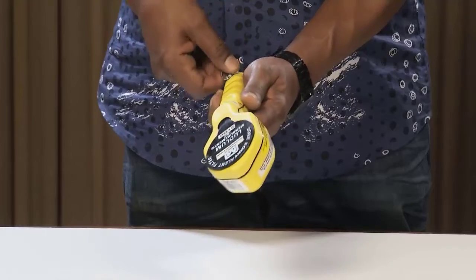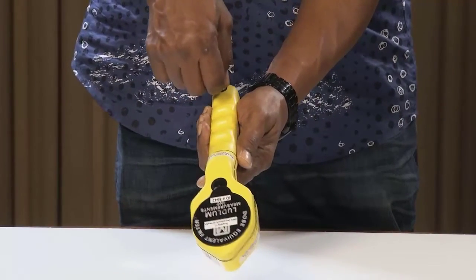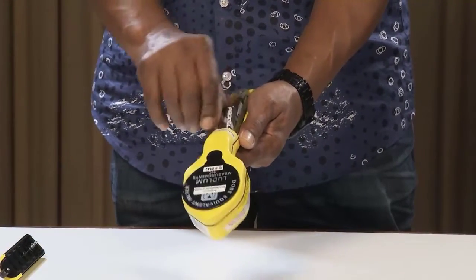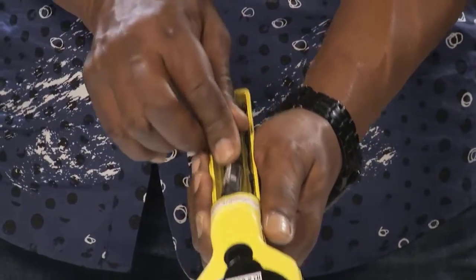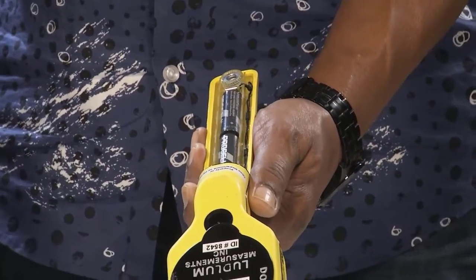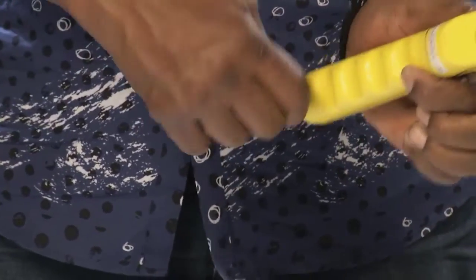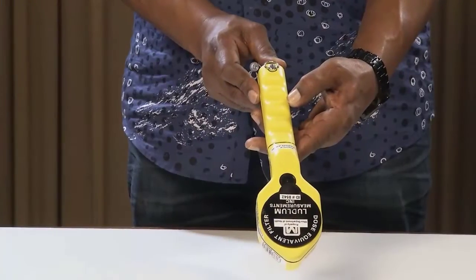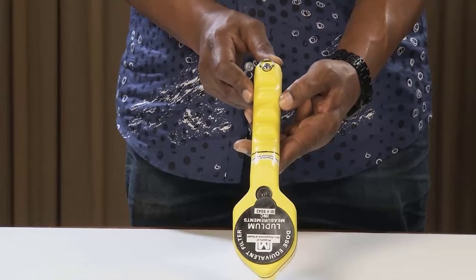Grab the ring on the screw and turn the ring one quarter turn counterclockwise. Release and remove the battery cover. Replace the two AA batteries. Firmly insert the barb of the battery cover completely into the body of the Model 26-3. Replace the cover by gently pressing down on the cover and turning the screw one quarter turn clockwise. If the barb is not inserted into the body of the instrument correctly, the barb may break off.